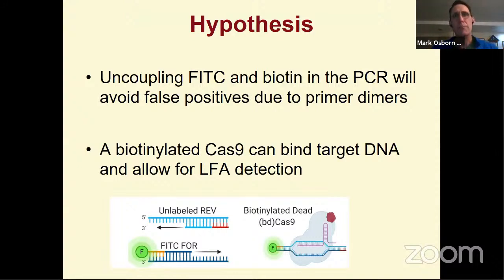And so building upon the fact that we know lateral flow assay technology requires a FITC biotin labeled analyte. However, when those molecules are incorporated into the primers during PCR, it results in false positives from primer artifacts. We hypothesize that we could uncouple those events, meaning that we could amplify the DNA target with a FITC labeled forward primer and an unlabeled reverse primer.